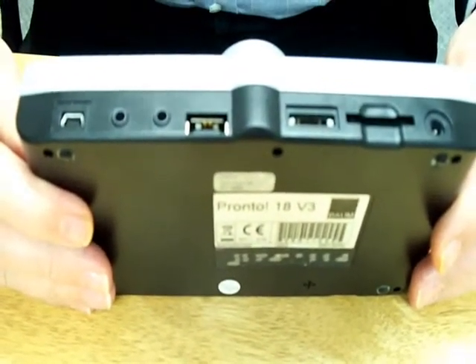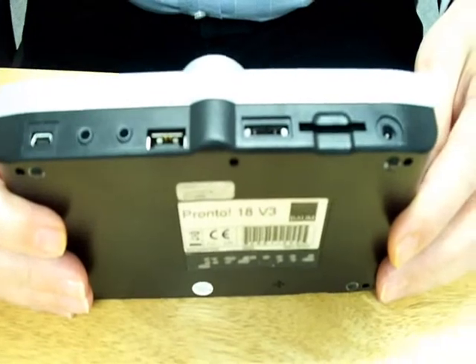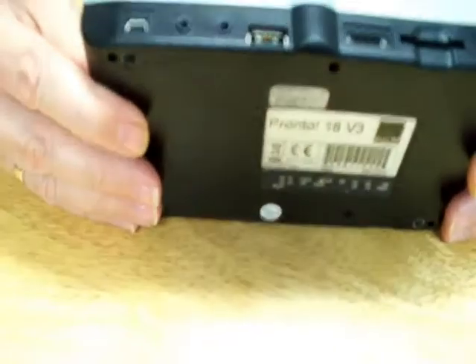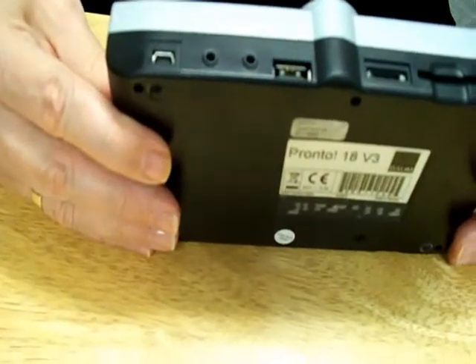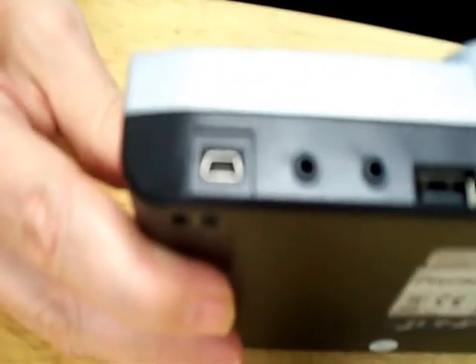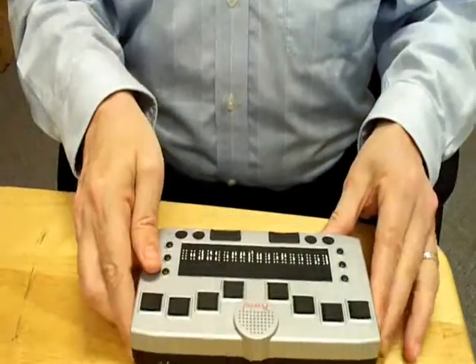Next to the Bluetooth raised area is the master USB connector. In this connector you can put thumb drives and other master USB devices. Next to them are two audio connectors. There's a connector for a microphone, monaural or stereo, and a connector for headphones, mono or stereo, whatever you choose. And next to the audio connectors is the slave USB connector. So there you have the back of Pronto, and you can see from that it's got a lot of functionality.